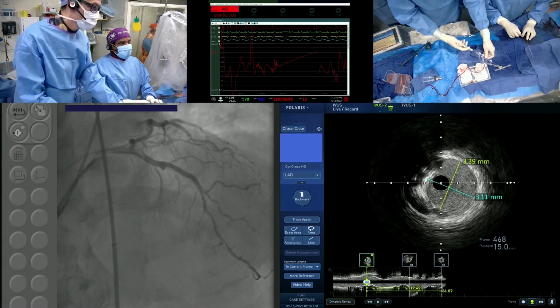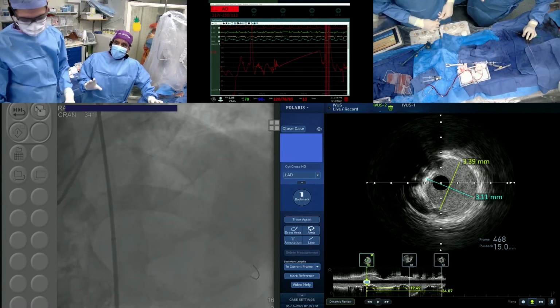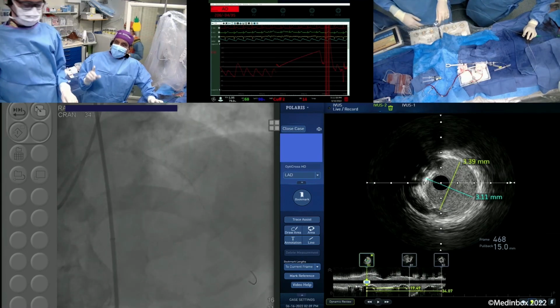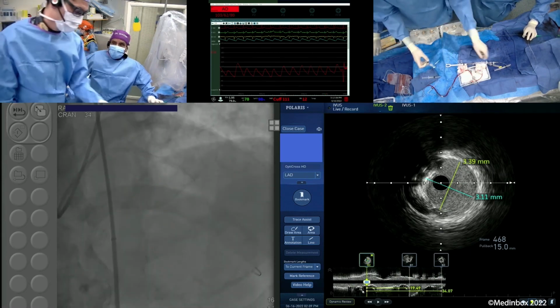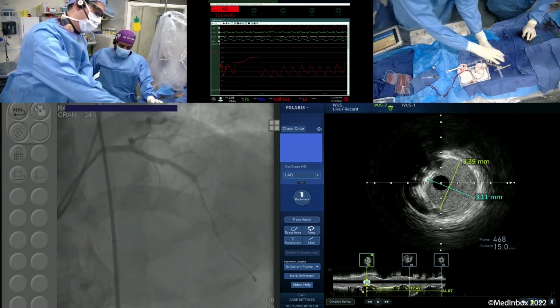Good. Look at the aneurysm size. See that the aneurysm has become half the size of before. This is exactly what we published in one case report. That aneurysm was 8 millimeters and became 4 at the time of stenting with a 4.0. With that note, if everybody is okay, we are ready to move on to room 2 for another CTO with Dr. Kini.